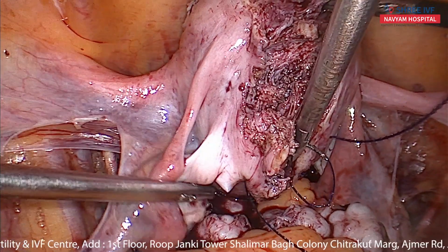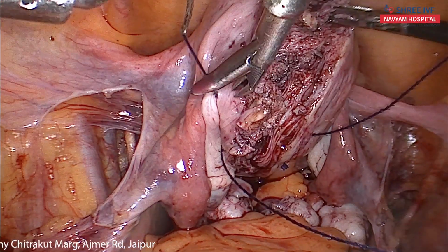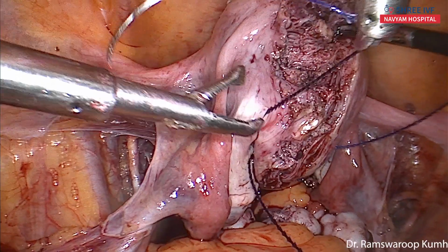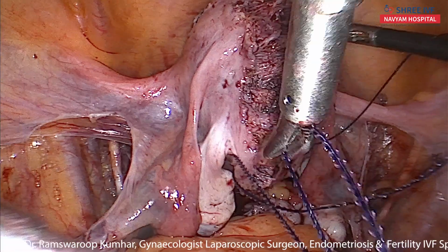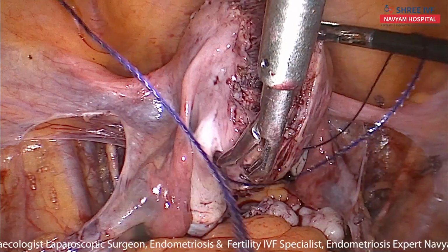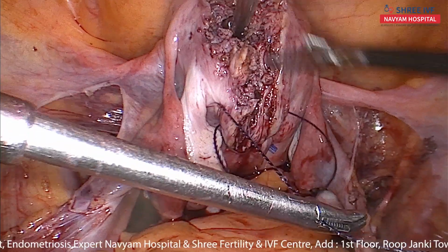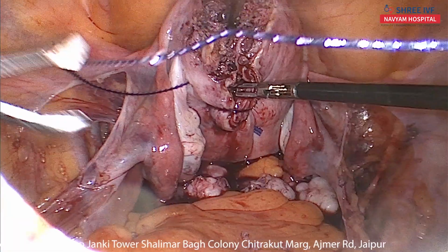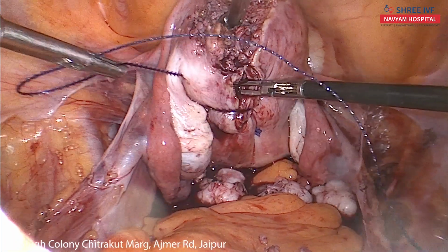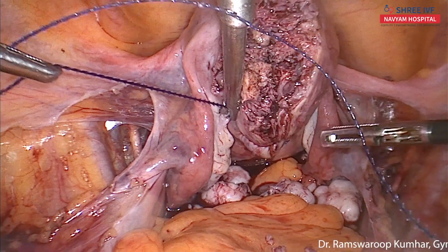I am facing some difficulty holding the needle holder with the tips of the fingers only. Not as tight.